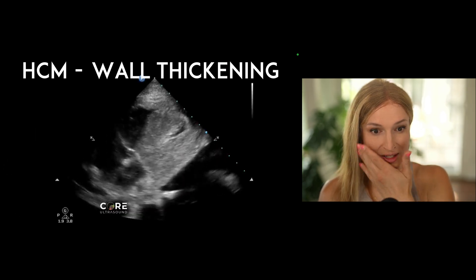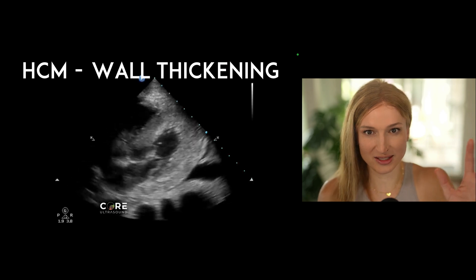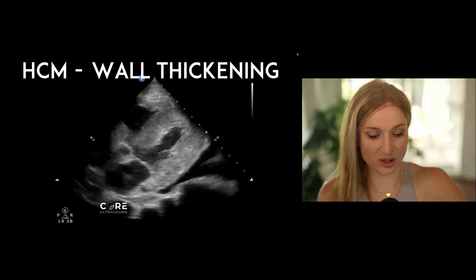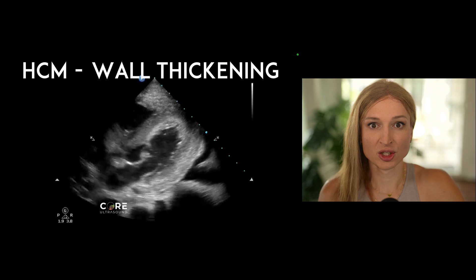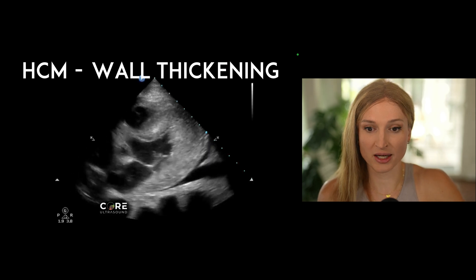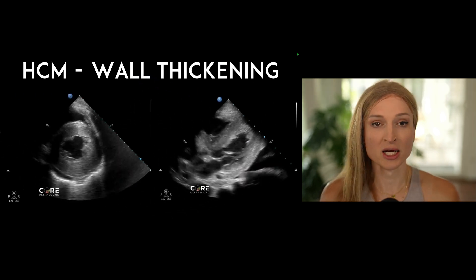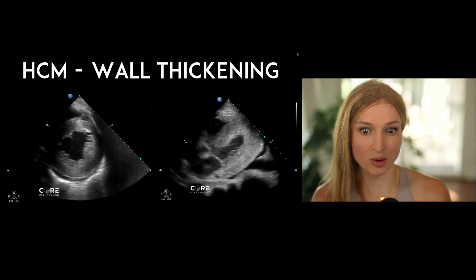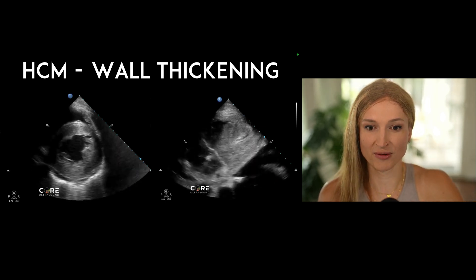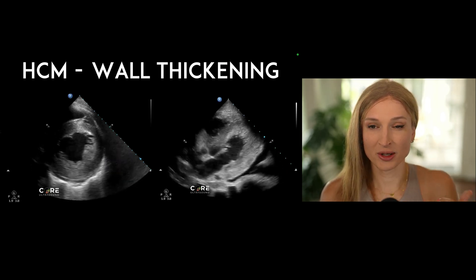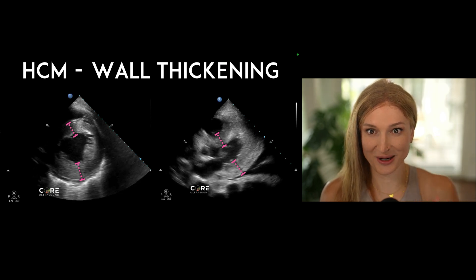Here's a patient with a bit of wall thickness. This one is a little symmetric on both sides, but just to show you where you measure — you can do this on the parasternal long axis view or the parasternal short axis view, just beneath the mitral valve itself. You're going to want to measure right here to get those ratios.